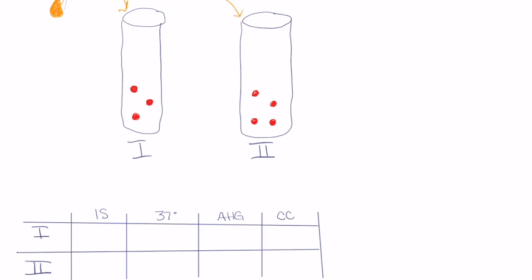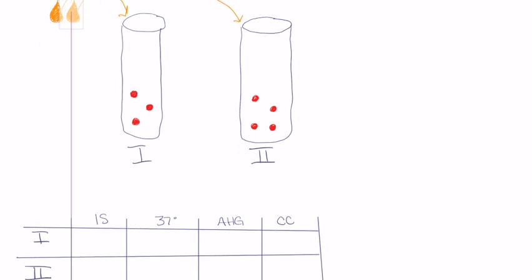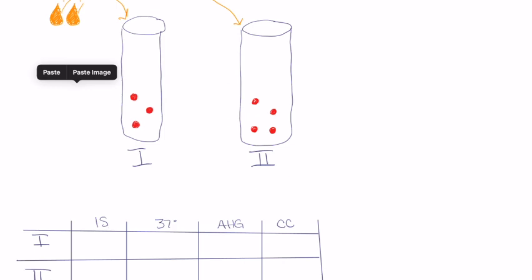And so that we see this, I'm going to go ahead and make 2 drops here so that you see 2 of them. So we put 2 drops of plasma in there. And one thing I want to talk about too is what's in this drop of plasma, what's in patient plasma. Okay, and what are we looking for in this screen, right? So we have screening cell 1, screening cell 2, 2 drops of the patient plasma, and our drop of plasma here, we actually know there's a lot of things in it.